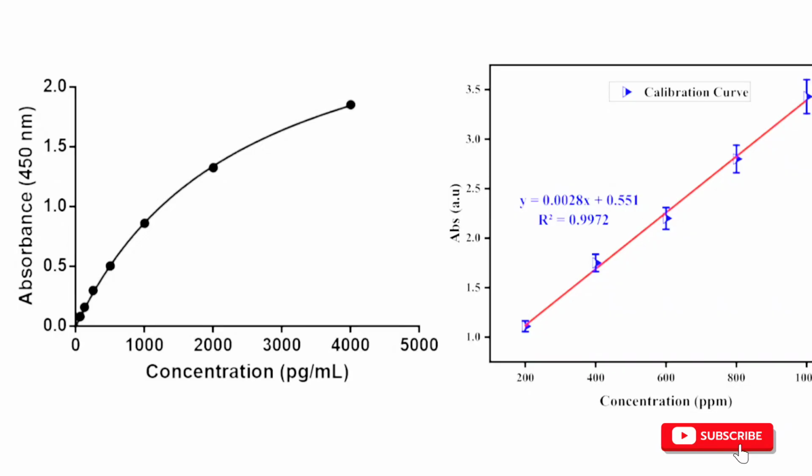Does that make sense? So what is going to happen is, if it gets something like maybe 2.5, it might still give you a result, but it's going to flag that it failed the linearity, or it might say outside linearity. Once it says outside linearity, it's now up to you as a biomedical scientist either to automatically set it up on your analyzer to do maybe a 1-in-1 dilution or a 1-in-2 dilution, as the case may be.